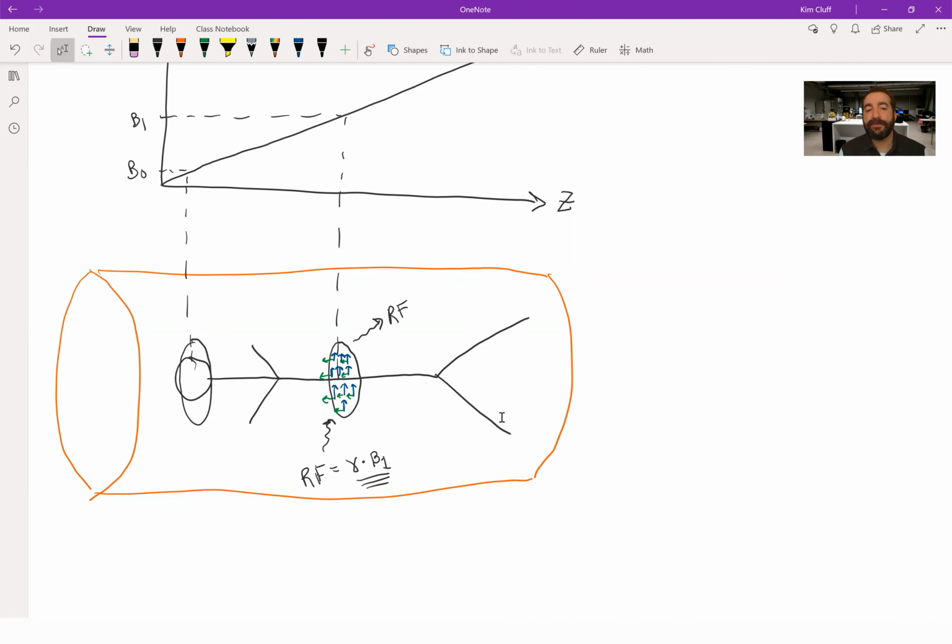So yes, you can use some external contrast agent to try to enhance the contrast, or to try to be able to see functional parameters. We'll talk more about that in the next class. So in that case, say you wanted to look at something other than the hydrogen atoms.